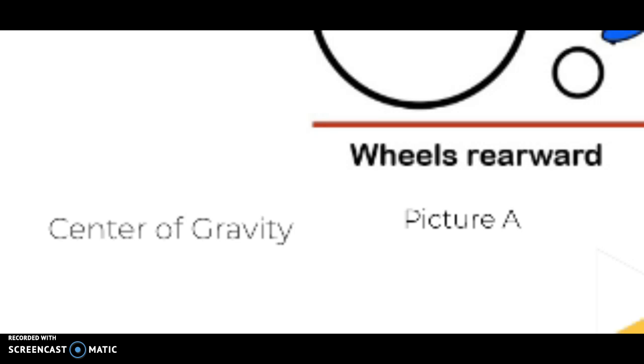The center of mass of an empty wheelchair is located under the seat in front of the drive wheels, which are the big wheels. When the user is seated in the wheelchair, the center of mass moves above the seat and forward and backward depending on the seat position of the individual and the drive wheels.